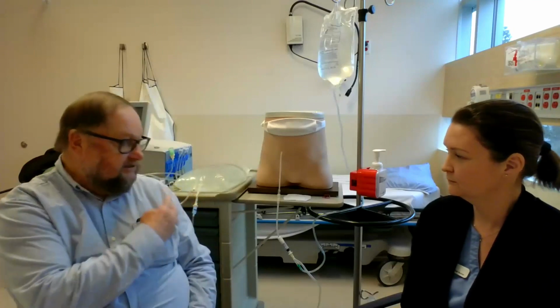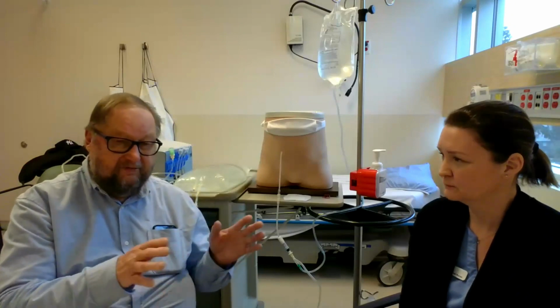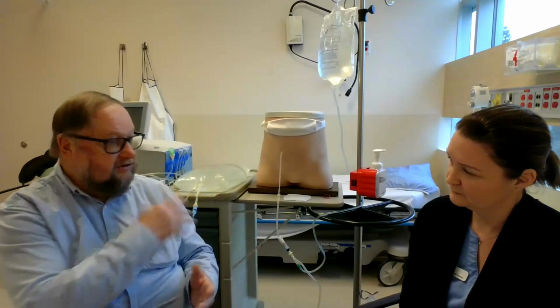And then in our actual bedroom where the cycler sits, we removed my nightstand and replaced it with, I guess, what you would call a microwave stand that had 3 shelves. So the top shelf easily fits the cycler and the modem, and also has room for some hand sanitizer.